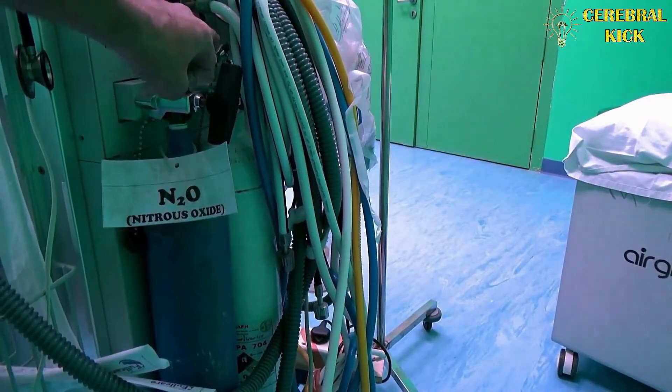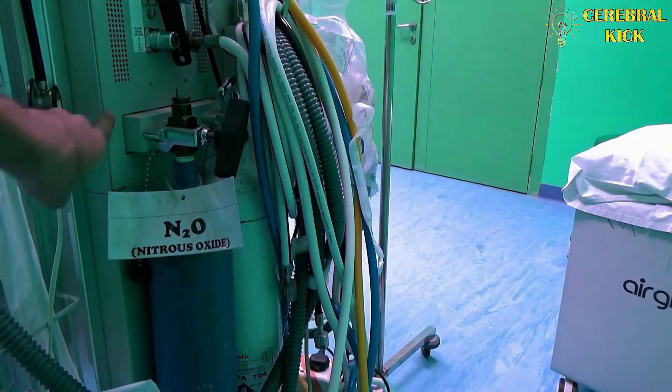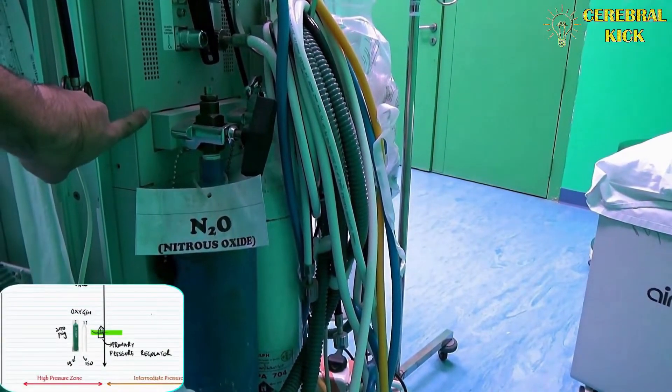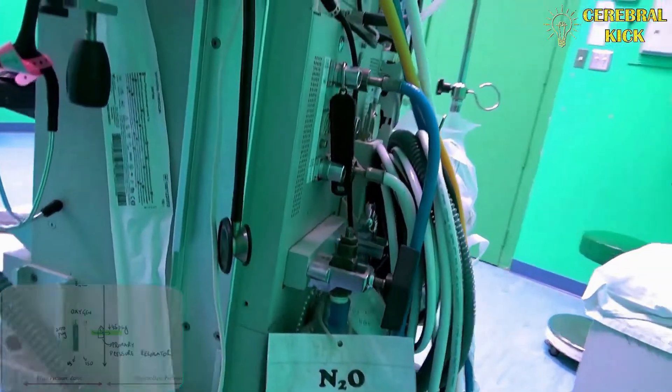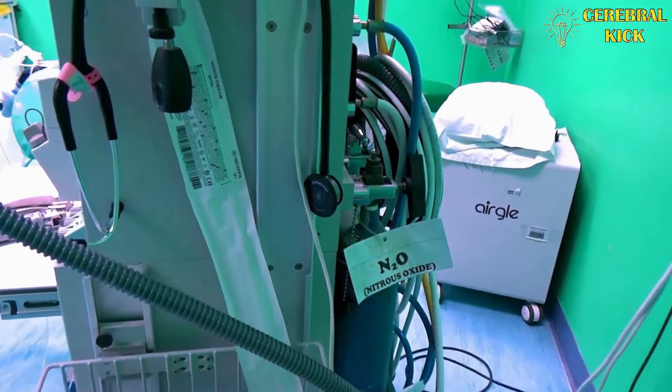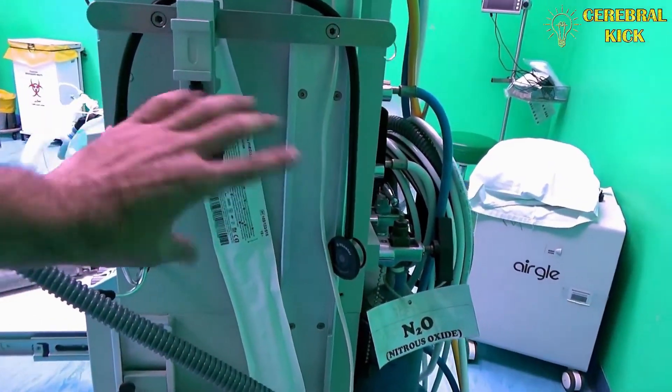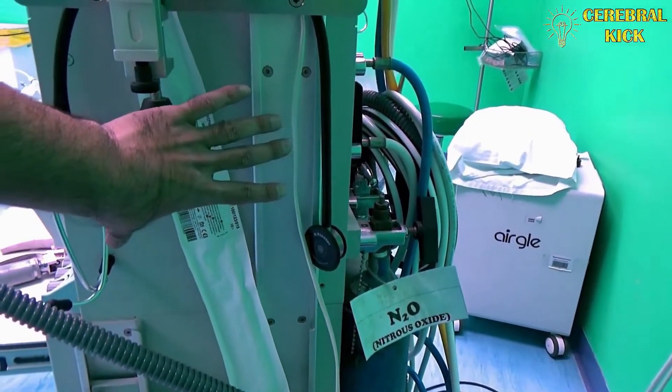Once this high pressure goes inside, there is a primary pressure regulator which reduces the pressures to 45 PSI. This is where the intermediate zone begins. Somewhere between the high pressure zone and the frontal low pressure zones, somewhere inside this panel which we cannot see, lies the intermediate zone.